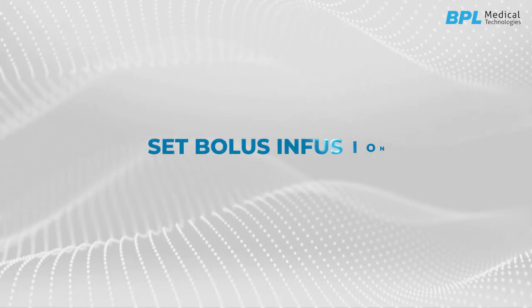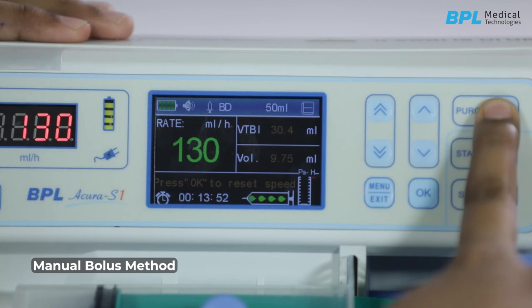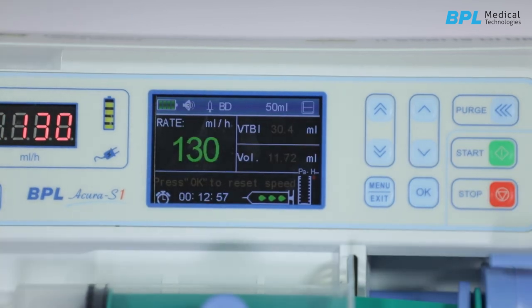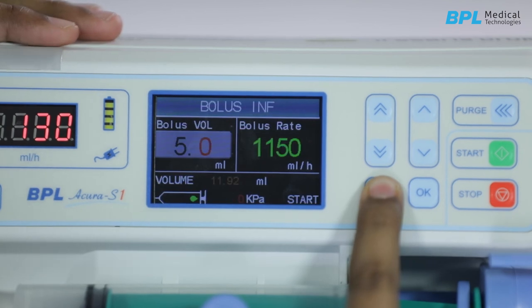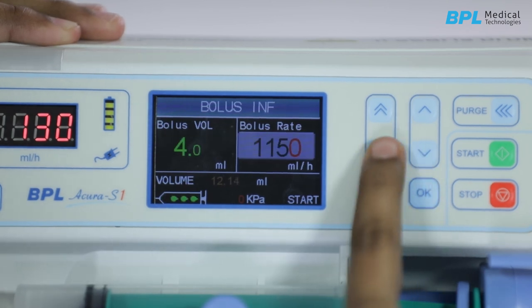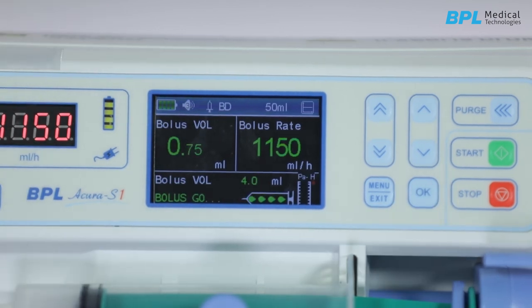Let us see how to give bolus infusion. There are two ways to set it. First, manual bolus method: press and hold the purge button — the pump will inject at the bolus rate corresponding to the syringe size; release the key to return to the original rate. Second, automatic method: during injection, press the menu key to enter the bolus volume setting interface, set the desired bolus volume, set the bolus rate, and confirm. Press OK — the cursor positions on start — then press OK to start. The pump will inject at the bolus rate of the corresponding syringe size.